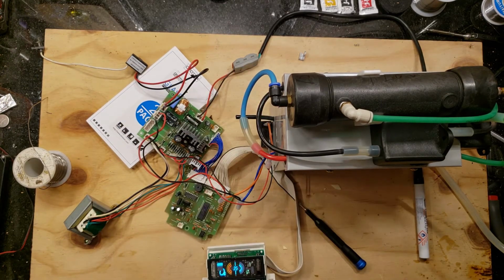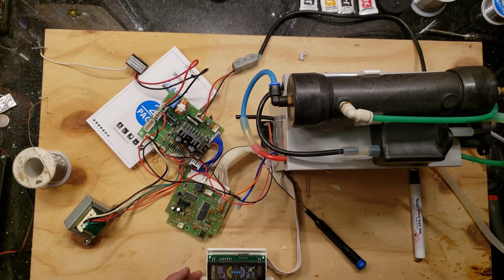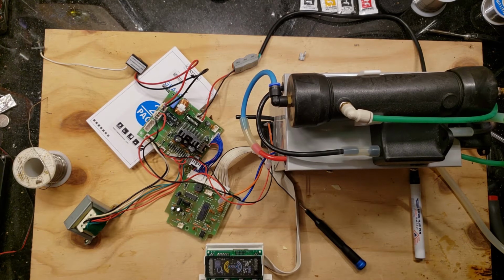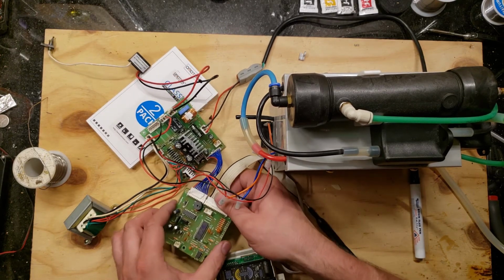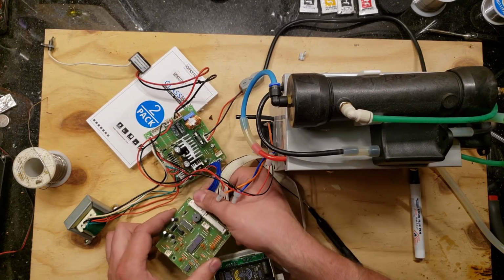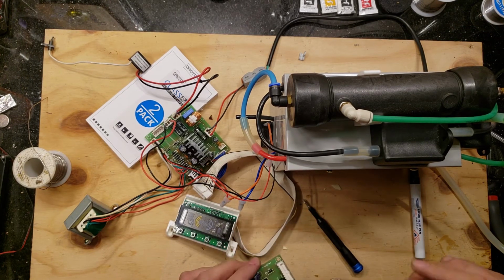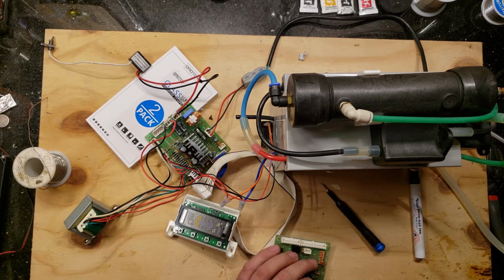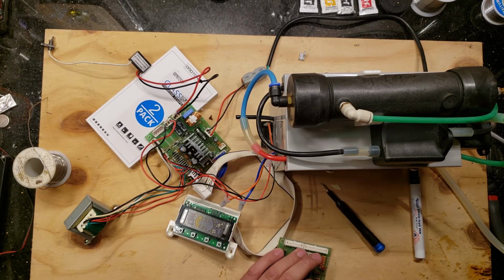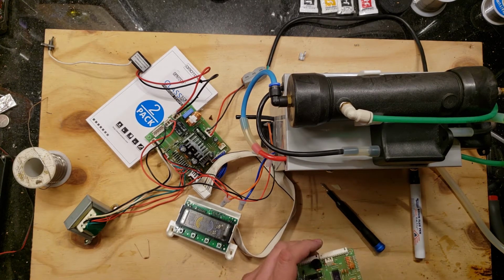This little fan's working too. This little fan's working. Yay. That seemed to have done it. Now I just got to do a slightly prettier job installing that resistor. And I think this system may end up controlling it once again.